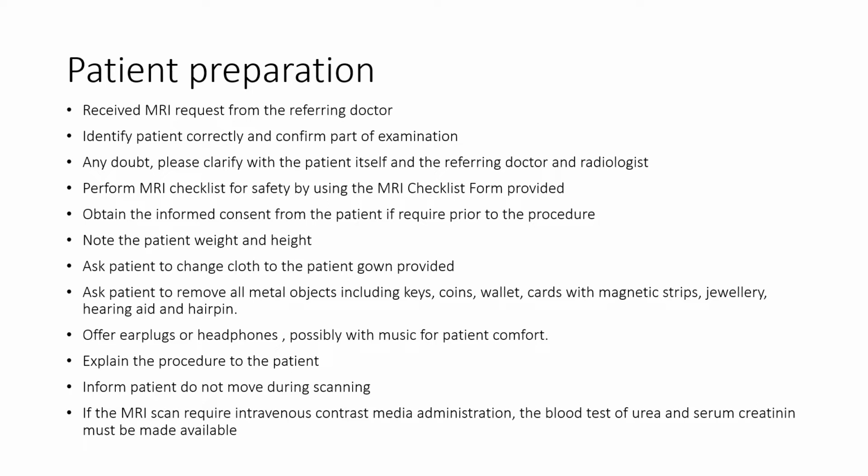MRI brain patient preparation. After receiving the MRI request from the referring doctor, the radiographer must identify the patient correctly and confirm the part of the examination. If there is any doubt, please clarify with the patient and the referring doctor or the radiologist.